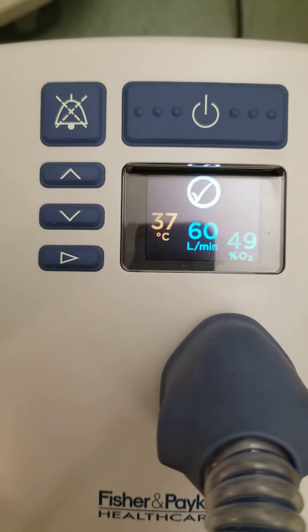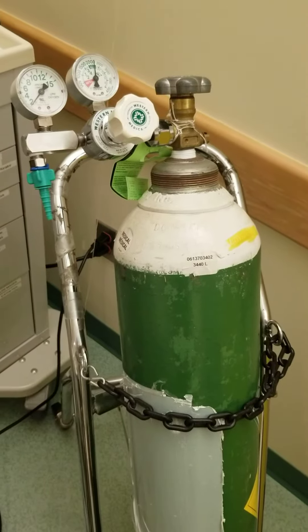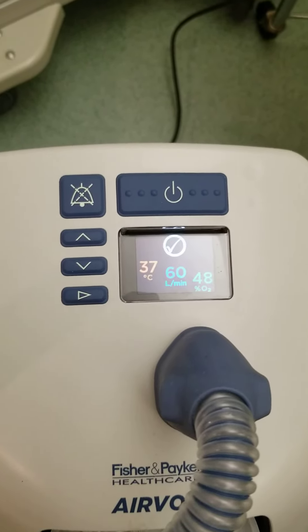If we connect an oxygen concentrator with just an oxygen tank and put them together in a T-piece, then we can go up to 54%.